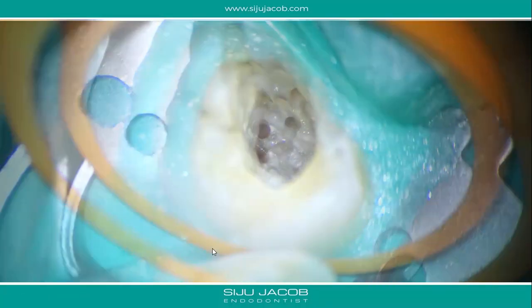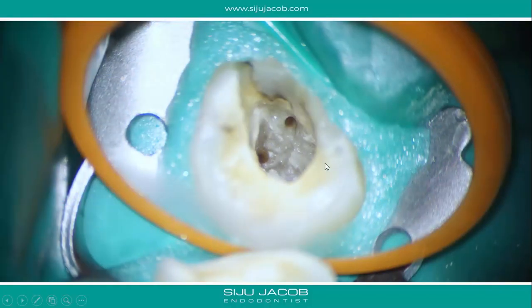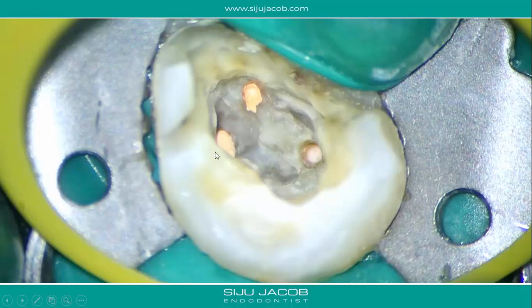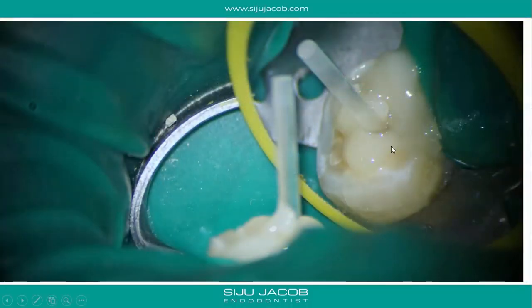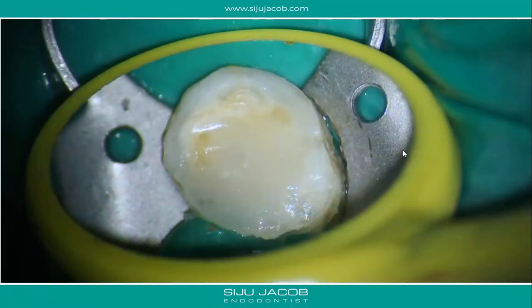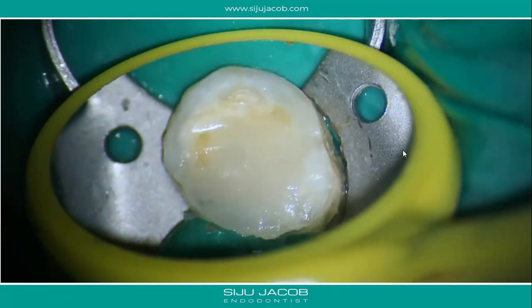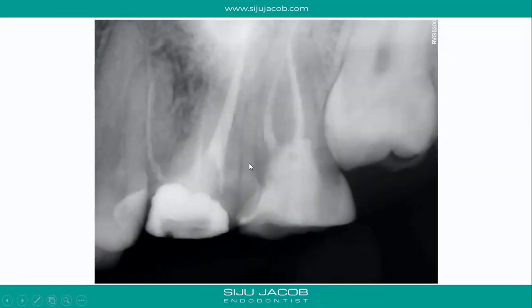Stepping back you can clearly see the mesiobuccal, distobuccal, and palatal canals. When we obturated we removed the filling, cleaned up the whole preparation, and built it up completely. We placed a post because quite a bit of tooth structure had been destroyed, and then this tooth was done.